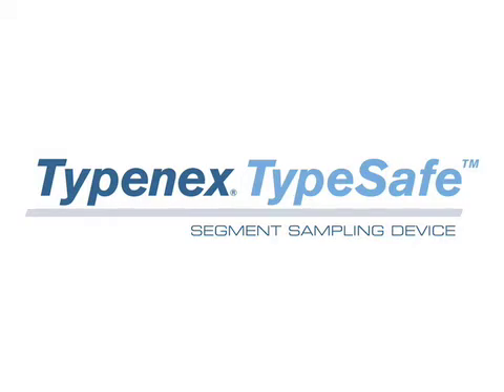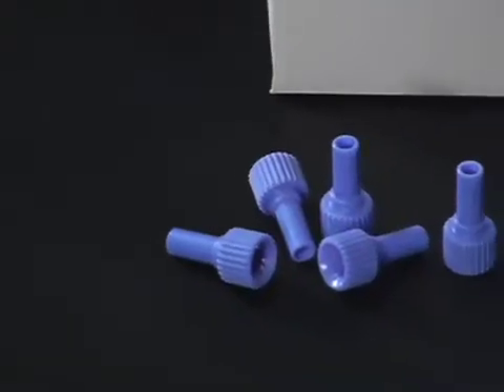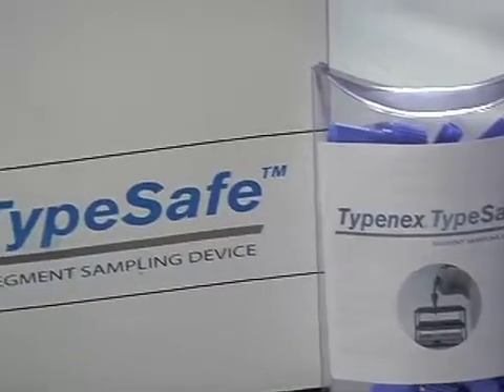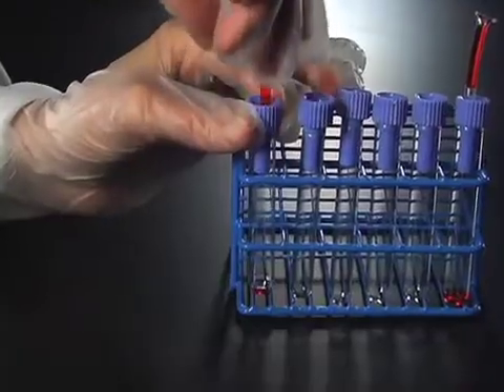TypenX is proud to offer you simple, efficient lab supply solutions that bring value to your blood bank. The Typesafe segment sampling device is intended for in vitro diagnostic use. Typesafe provides a safe means to puncture blood segments for cross-matching procedures without using scissors.